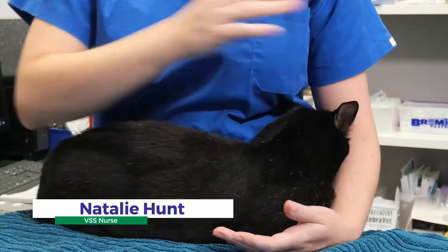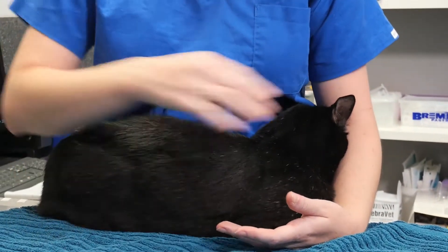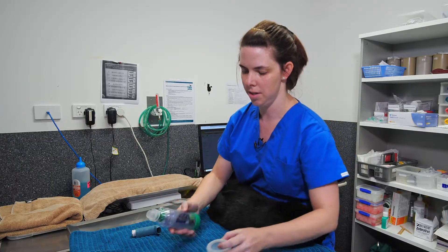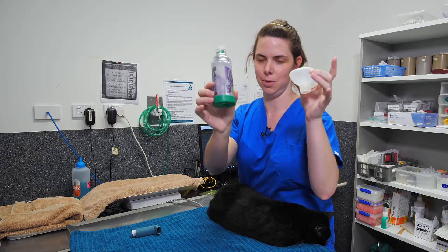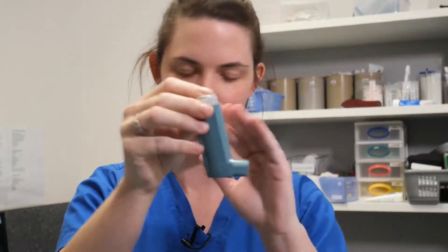I'm Natalie, one of the nurses working at Veterinary Specialist Services, and this is Midnight. Today we are going to show you how to use the AeroCat inhaler system. What you get in your box is two of these chambers in two different sizes, and your veterinarian will give you an inhaler as well.